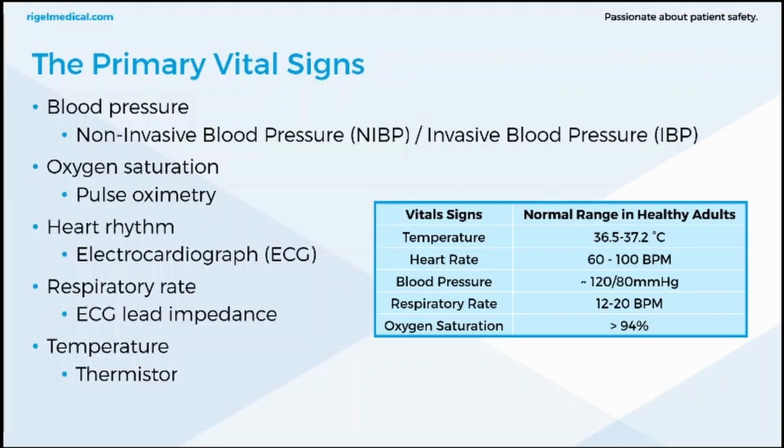There are also methods of measurement used in healthcare, but we're talking about simulating and measuring on patient monitors where thermistors are primarily used. And we've got the normal range in healthy adults for each of these vital signs, and then any values outside of these ranges alert clinicians to a condition deteriorating that needs to be monitored.